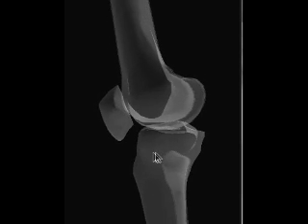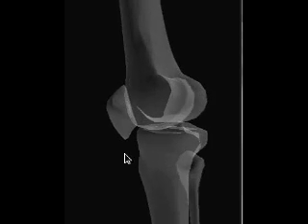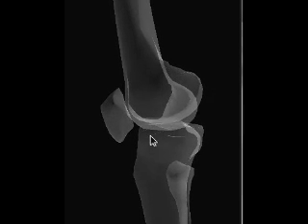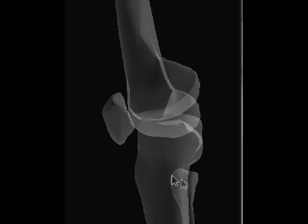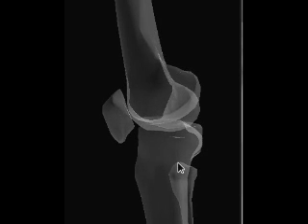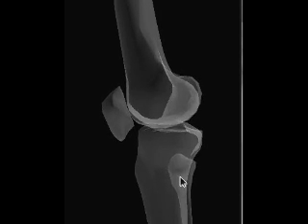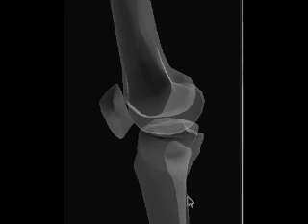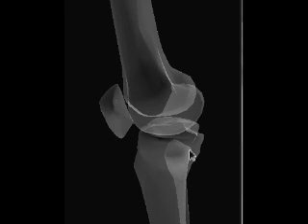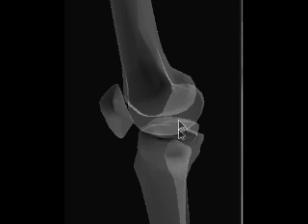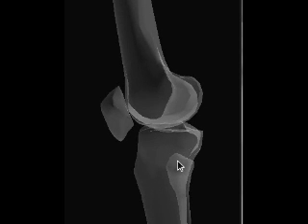At the same time, as we angle our tube cephalically, you can see that the proximal tibia appears to move southward — it appears to move inferiorly. And if we angle the tube caudally, then the proximal fibula gets really close to this medial condyle here. It appears to move north and the condyle appears to move south, so they come really close to each other.